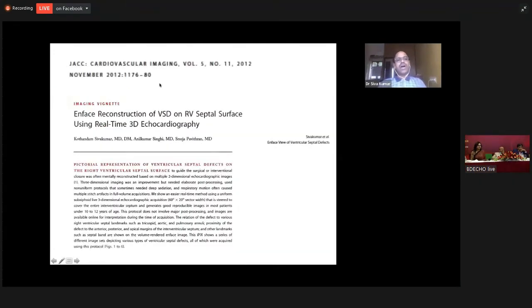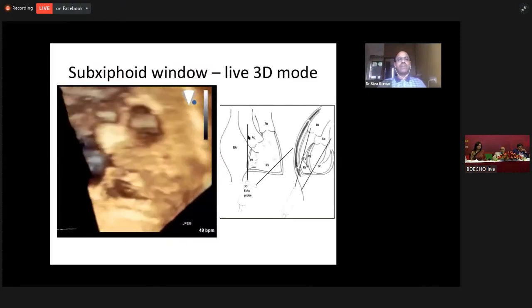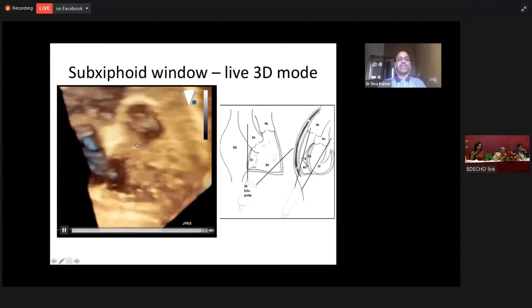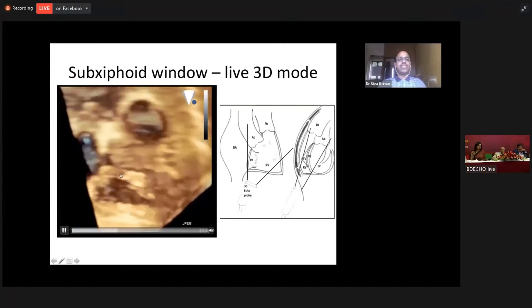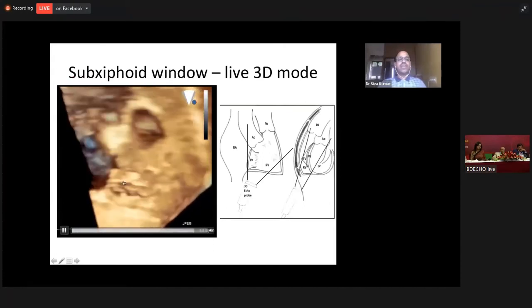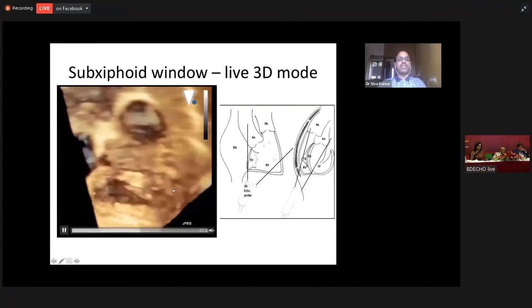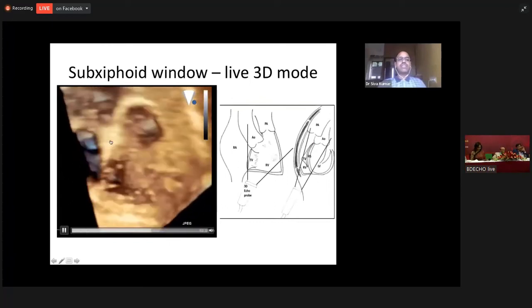We wrote a paper on en-face reconstruction of ventricular septal defect by 3D echocardiography. I will show how a 3D echocardiography looks like. This is the 3D echo showing the inlet septum, the trabeculo septum and outlet septum, and this is the membranous septum.